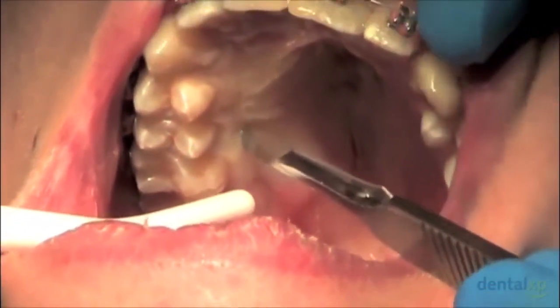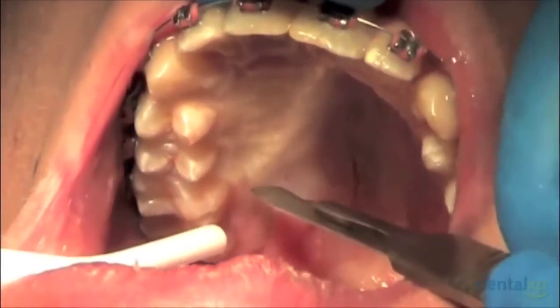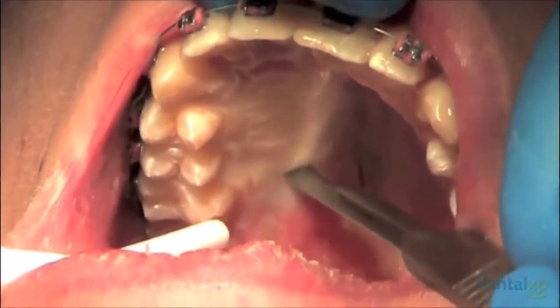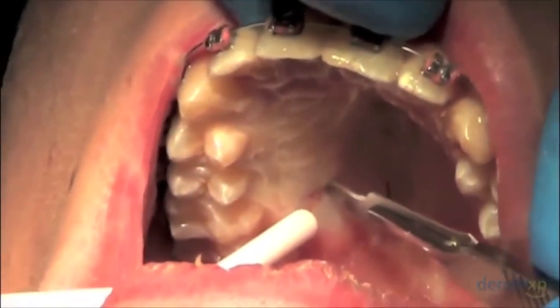Unlike the subepithelial connective tissue graft, which is typically performed for root coverage purposes, the free gingival graft that we're doing today will include both the epithelium as well as the connective tissue layers of the palate.